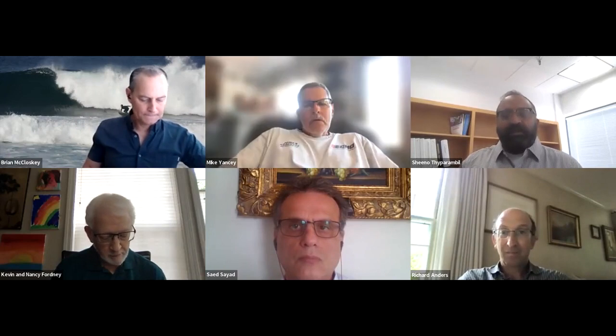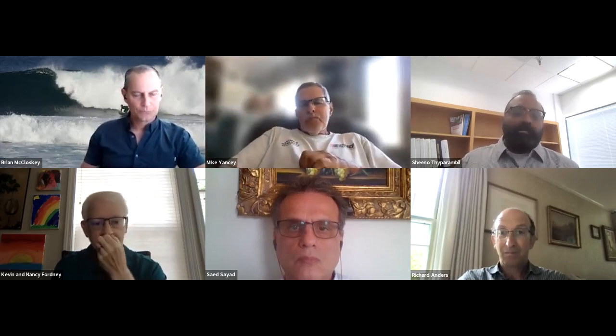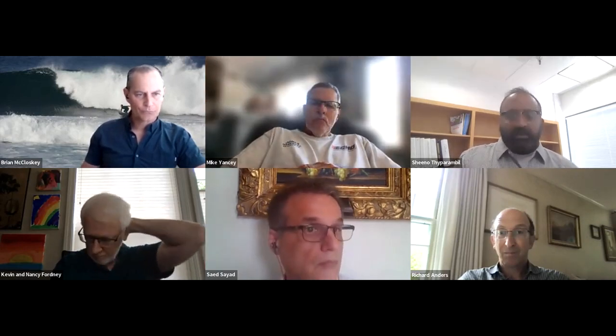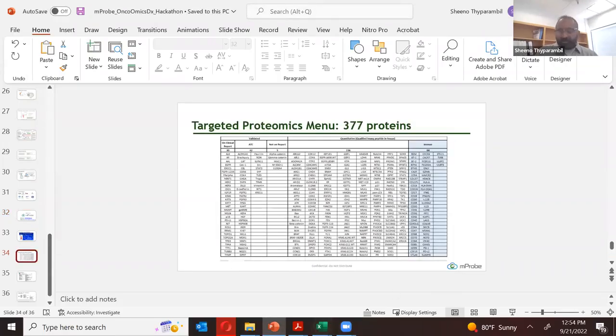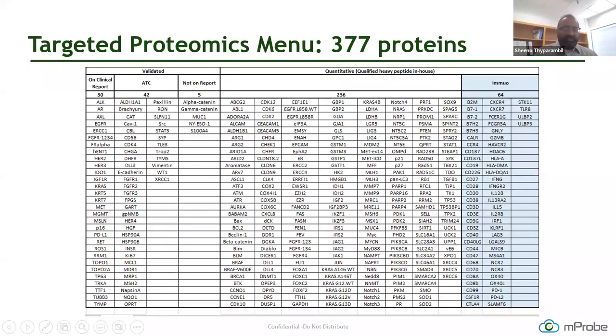In our research panel, we honestly have something like 377 assays. It's a research panel. We have had instances where folks will come and say, I would like to see Claudin 18.2. Is it expressed or not expressed? Or I think even B7H3 might be part of it. Let me reshare the screen. This is going to be very small. B7H3 is part of our panel, I need to go back here and show you. There it is.